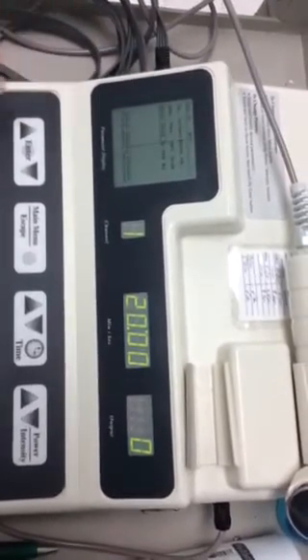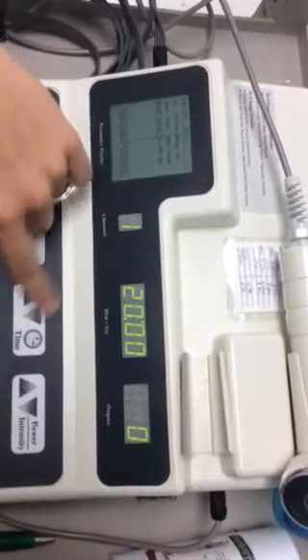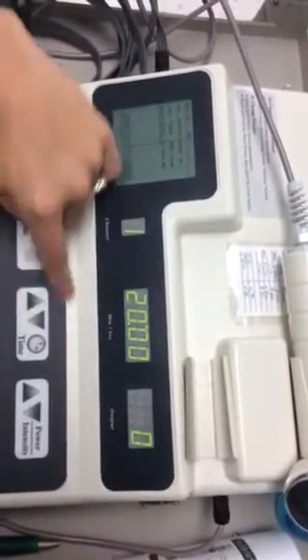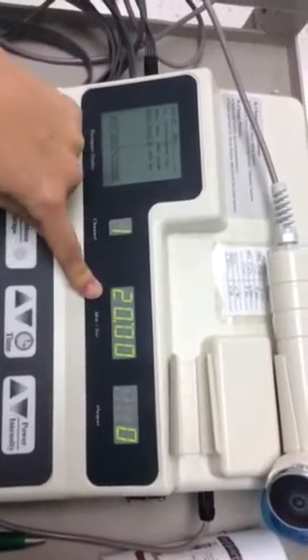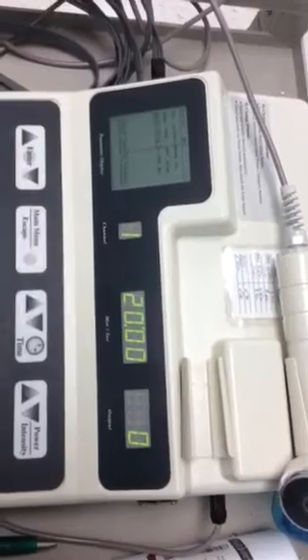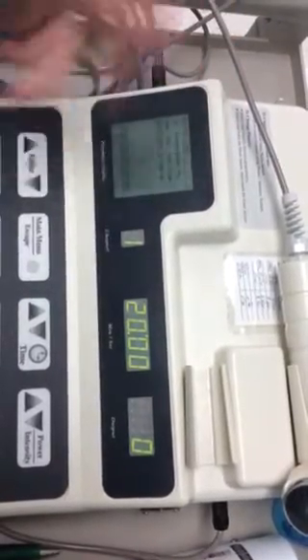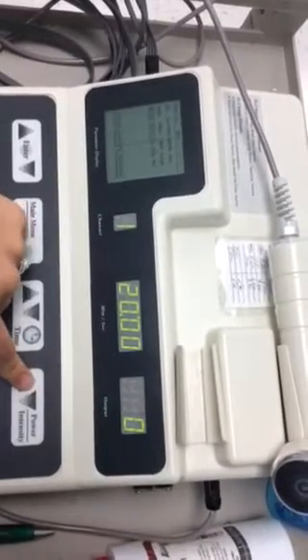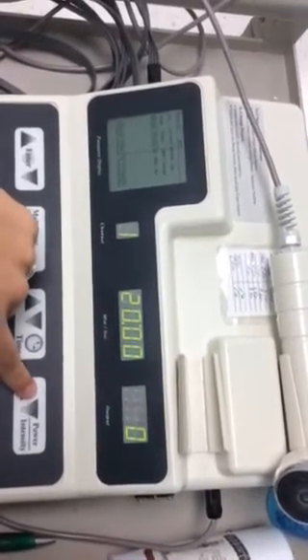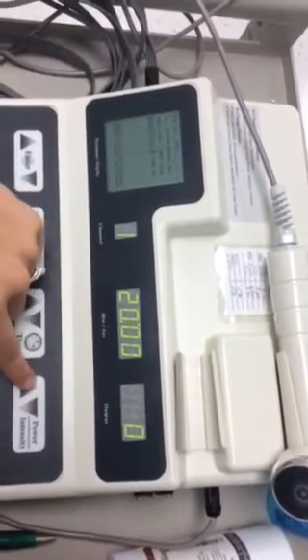You set it up quadrupolar, and time is here. If you want to change the time of the treatment, 20 minutes to 30 minutes is usually a good treatment time for pain relief. In the clinic, they can have one at home that can go up to an hour. You will turn up the intensity to something that is a buzz, does not cause a muscle contraction, that's strong but comfortable for your patient.